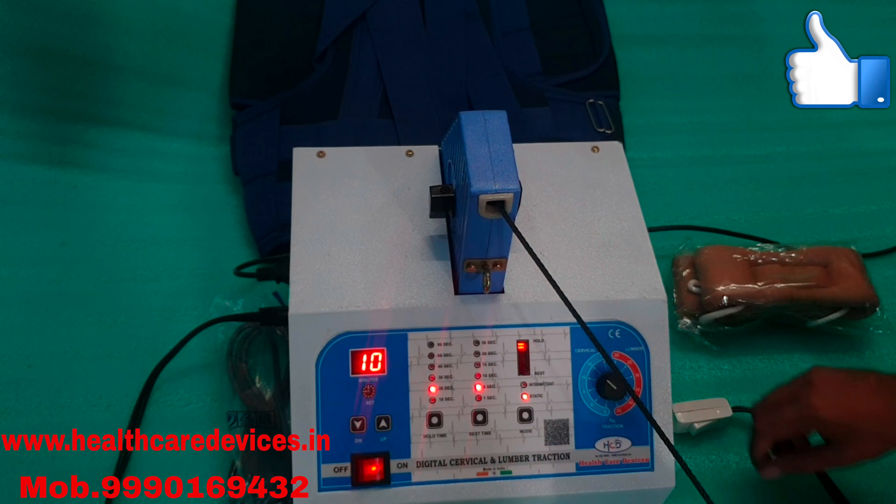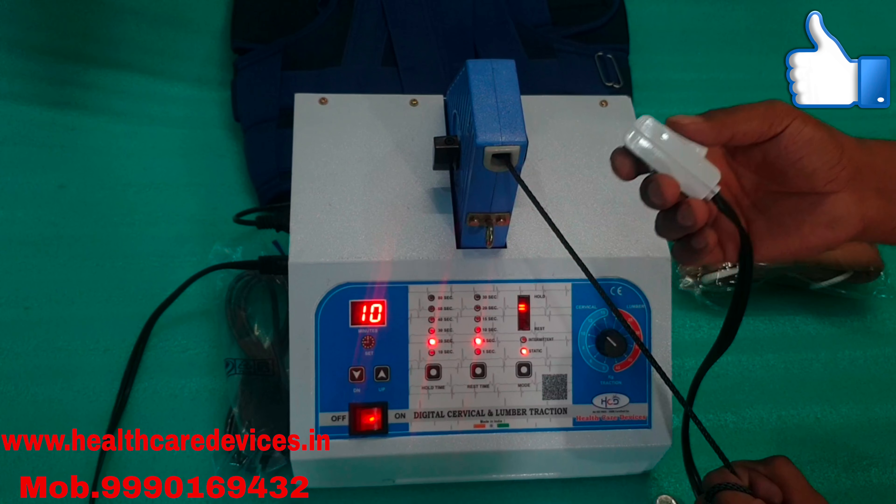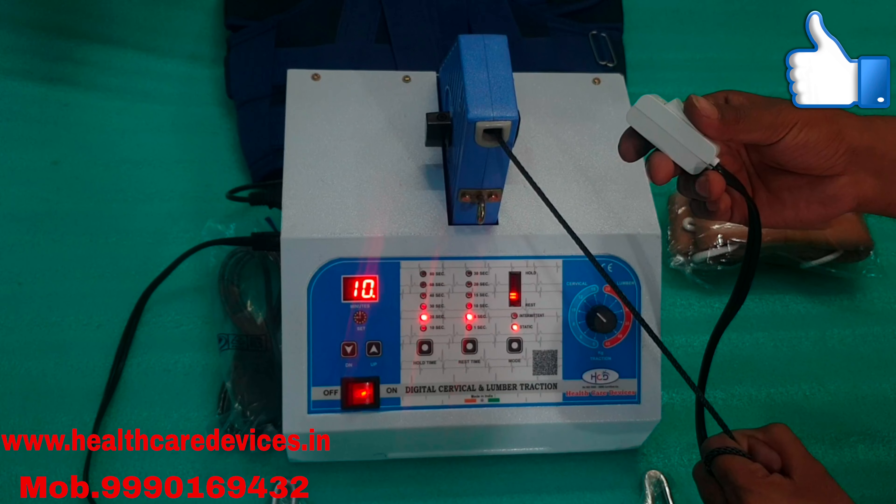If the patient wants to stop, this button will stop the machine. Then the machine will stop.